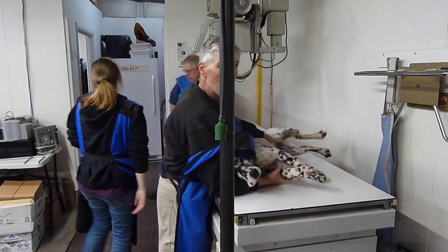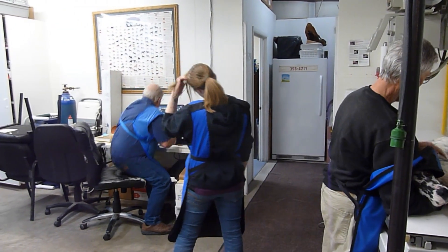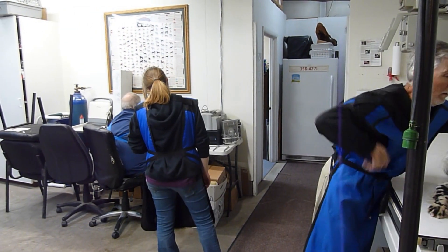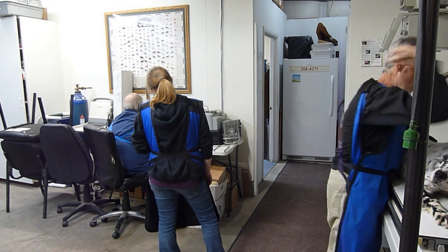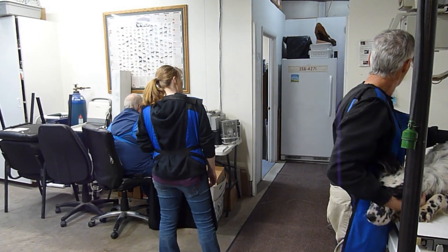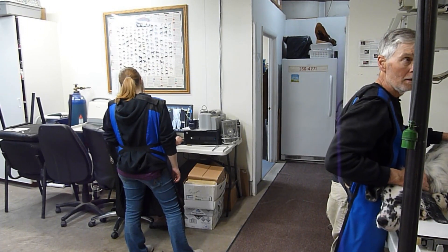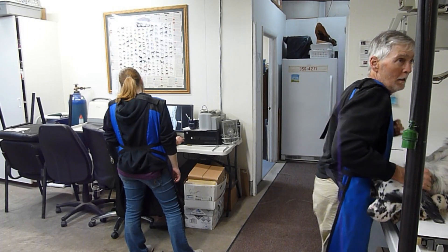Okay, let's see how that looks. I think we've got her first crack, folks. Look at that. You can tell it's perfect to go right over. We've got a nice, common sizing. I think that's a go.